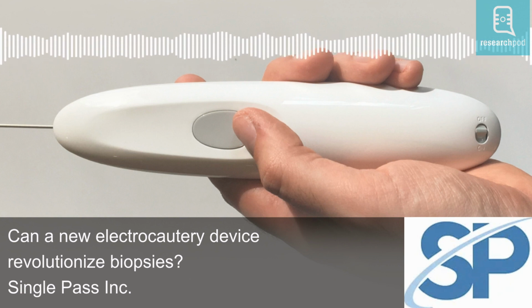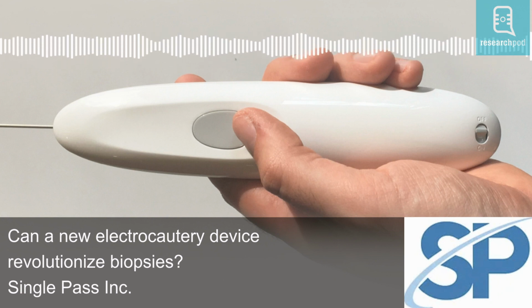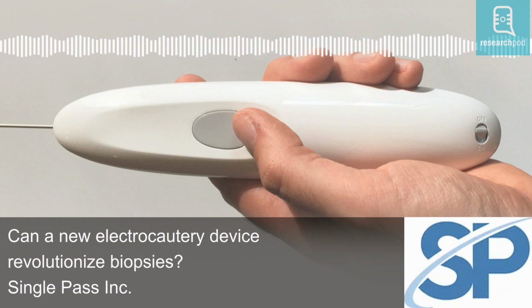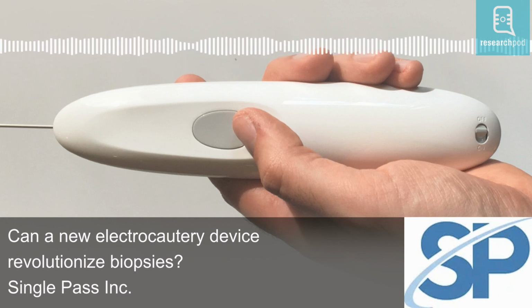The Single Pass device works through cauterization, the technical term for using electricity or chemicals to seal a wound by stopping bleeding. The device is able to control bleeding by heating the tip of the device probe via an electric current. This heated tip is applied directly to the biopsy site, coagulating the tissue and preventing bleeding. It might also sometimes be used to remove harmful tissues.